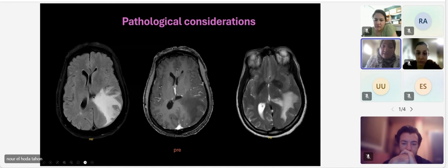So you can see here the posterior horn is really compressed. And again here, the frontal horn is compressed and effaced. And there is some entrapment on the right side. So all of this is mass effect. And you can simply know the vasogenic edema.